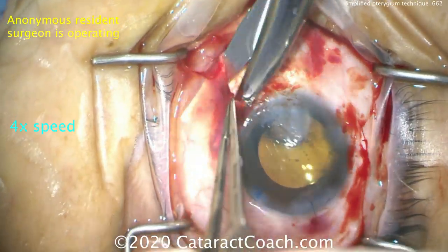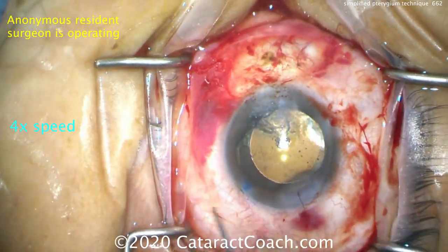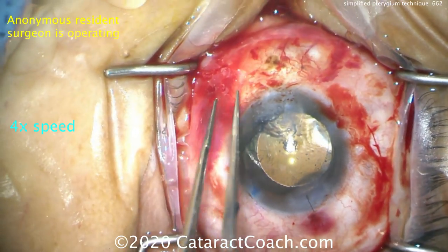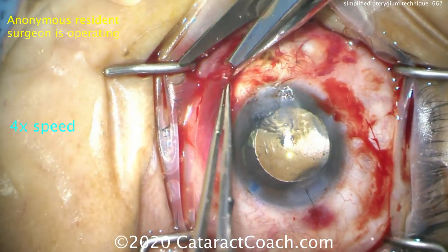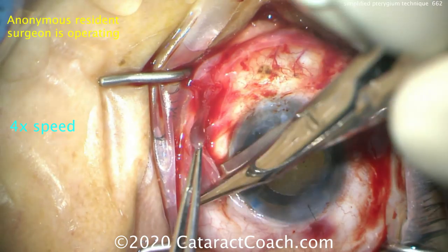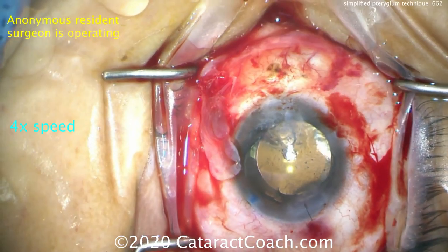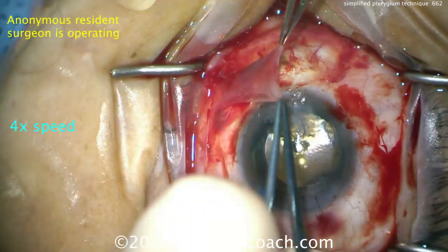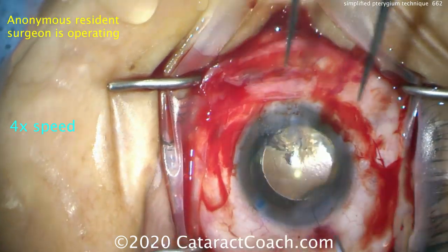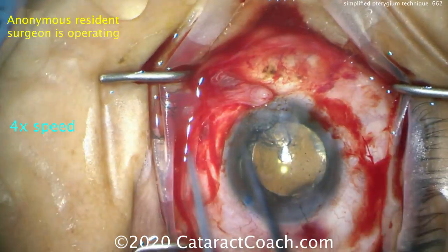Here's the end of the case. You can see the cataract has already been done as well. Now the conjunctiva is dissected and we're going to create a U-shaped flap superiorly — a rotational flap. If you cut this around in a U-shape, there's the base of the U, coming back from the other side. Now that conjunctiva is still attached and can be rotated 90 degrees and placed up against the limbus.